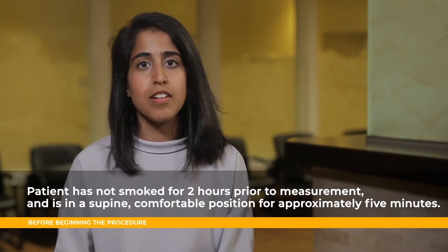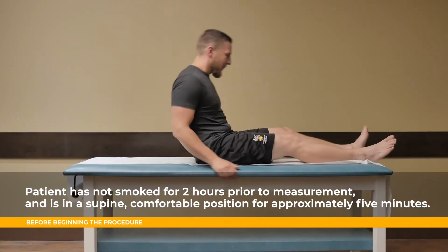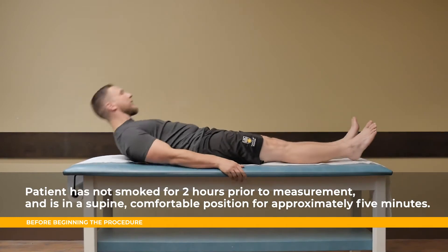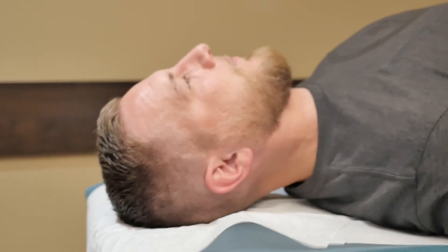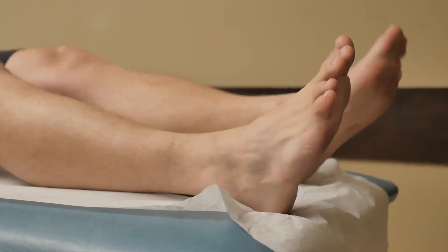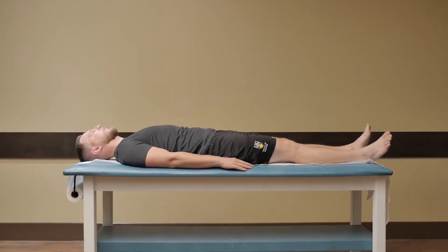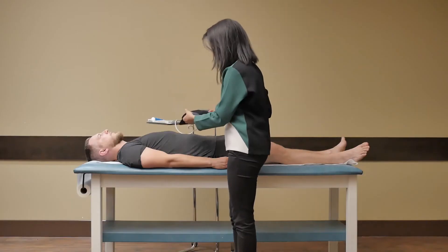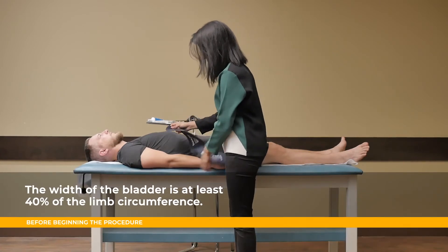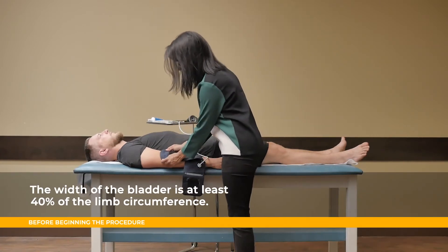To begin, ensure the patient has not smoked for at least two hours prior to measurement and that they are in a supine, comfortable position for approximately five minutes with both their head and heel supported, and that their arm is at the level of the heart. Select an appropriately sized cuff for both the arm and the ankle, ensuring that the width of the bladder is at least 40% of the limb circumference.